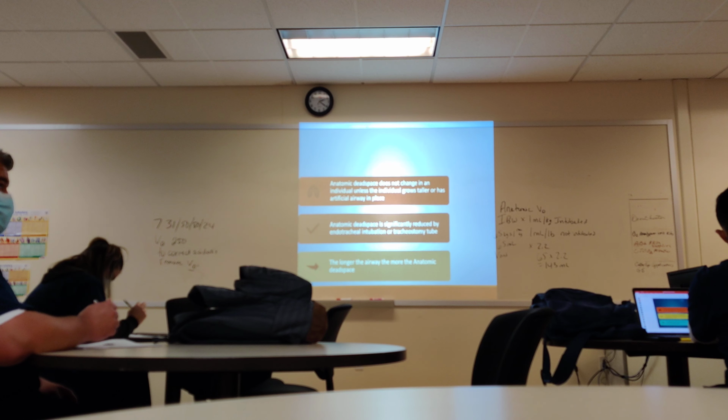The longer the airway, the more anatomic dead space. So somebody with an ET tube is going to have a little more dead space than somebody with a trach. So a trach is the shortest amount of mechanical dead space we can offer a patient, which is another reason why having somebody trached is nice.